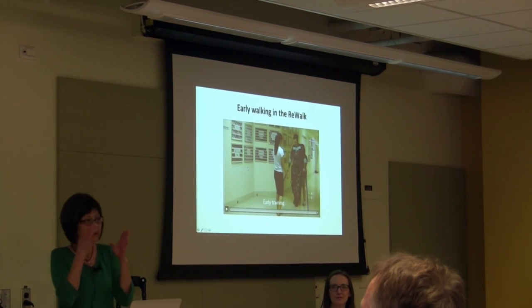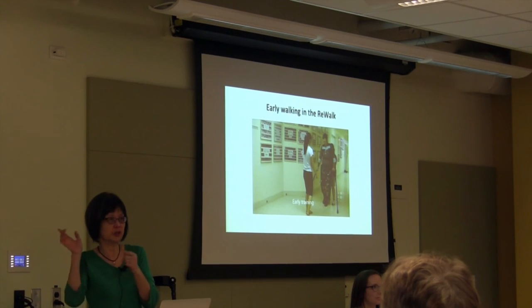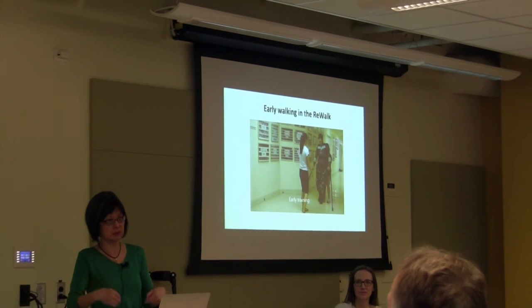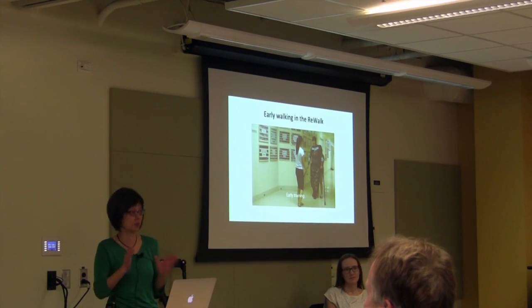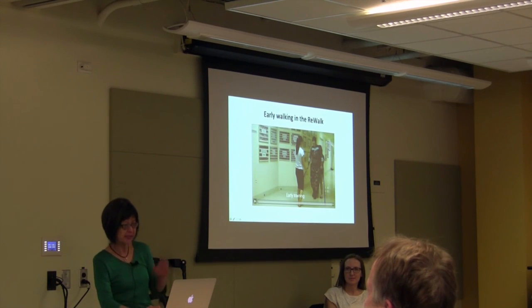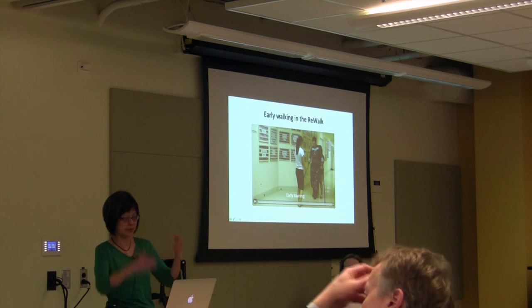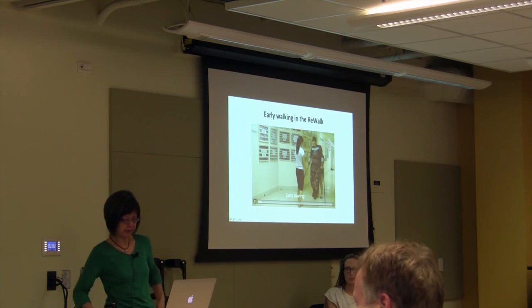The one thing I want to emphasize is that it actually takes quite a long time for people to learn to use this device. It is not that intuitive. Even when we go in the device, it takes us a little while to actually make it work. But this is after this person had trained for quite a few sessions and could make continuous steps. So this is his early-ish training.